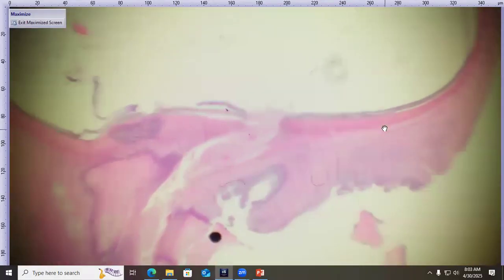Now, do we have an intact stroma here? So it doesn't look like in this particular section that there's a perforation. As we move back, there was a lens at one point, but it got kind of chunked out, so artifactually it's missing. But the iris leaflets look pretty good. As we move back further, the rest of the intraocular structures aren't particularly exciting at the subgross view.